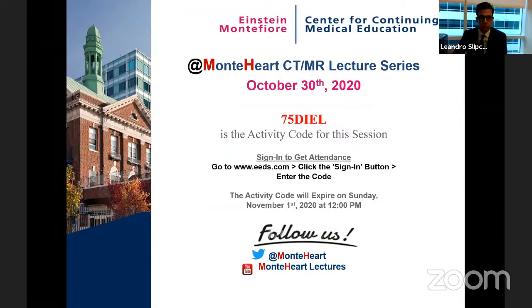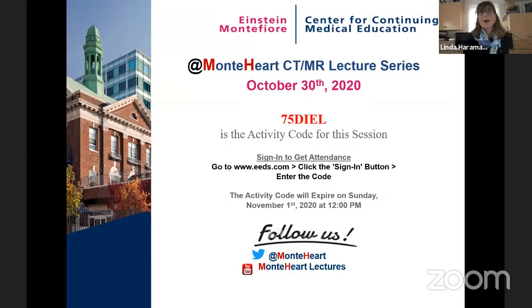What do you recommend to get such beautiful pictures? Do you ever switch to a test bolus, or do you ever tell patients to do the acquisition during expiration or with a sharp inspiration? What advice do you have for the acquisition? For CT? Yeah. So when we do a cardiac gated CT, to look for a shunt or basically any cardiac CT for anomalies, we always do a test bolus.